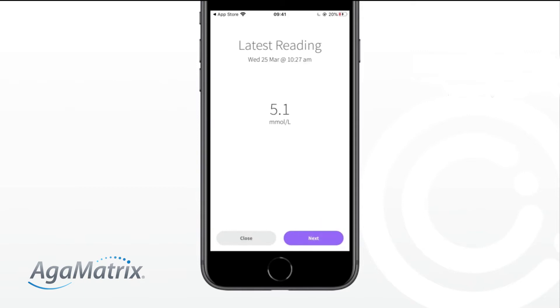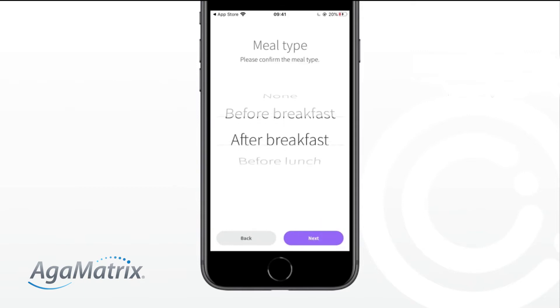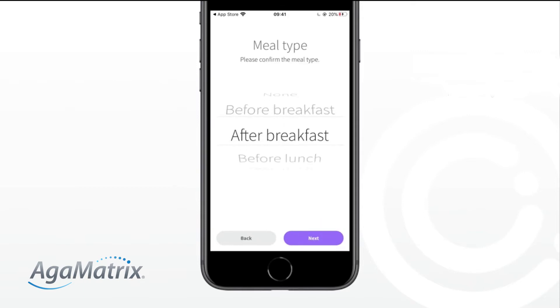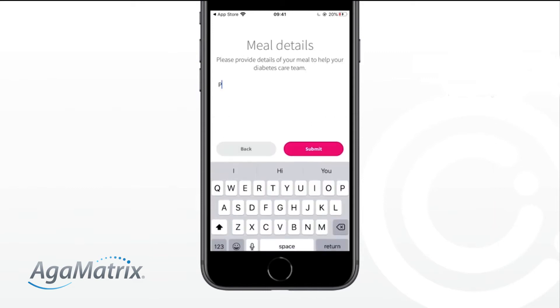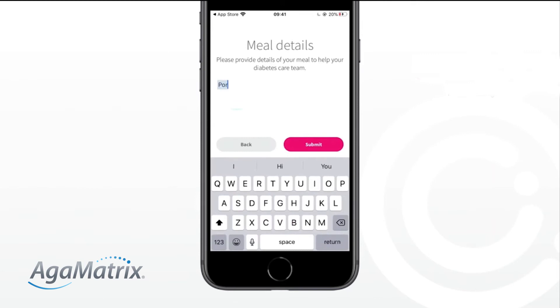Tap Next. Select a meal type by scrolling and confirm by tapping Next, and then enter any relevant meal information. Then select Submit.